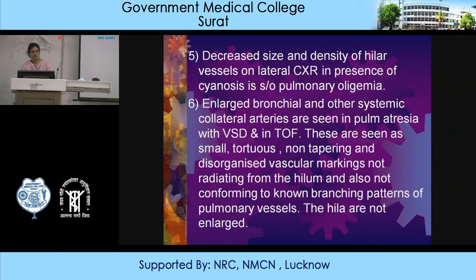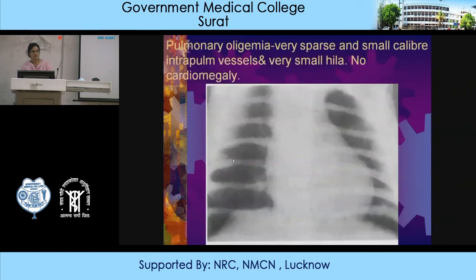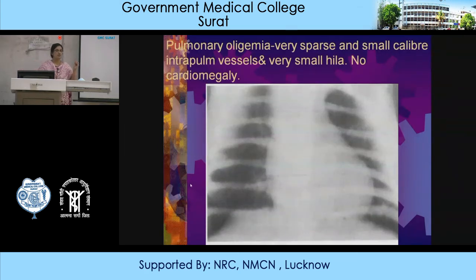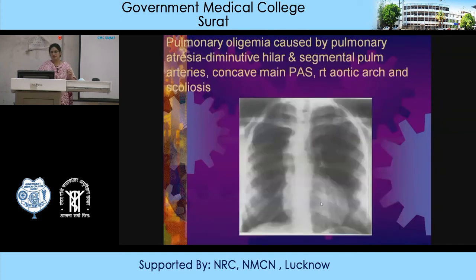This is a case of pulmonary oligemia — it appears as if there is an over-penetrated film because the blackness of the lungs is very prominent due to decreased vasculature. Another case of pulmonary oligemia caused by pulmonary atresia shows diminutive hilar and segmental pulmonary arteries, a concave main pulmonary arterial segment, a right aortic arch, and scoliosis.